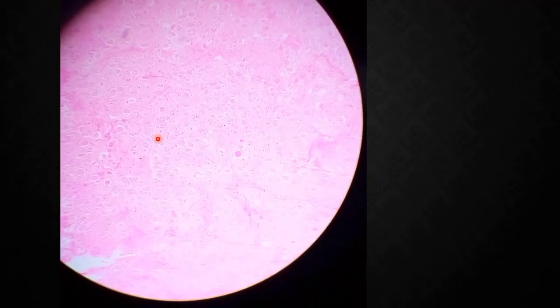This is the histological slide image showing how to identify the sympathetic ganglia. These are all the multipolar neurons. Can you identify here? Multipolar, having many poles, and the cell size is smaller when you compare with sensory ganglia. The number of satellite cells is also less compared with sensory ganglia. The type of neurons present in the sympathetic ganglia are multipolar neurons.